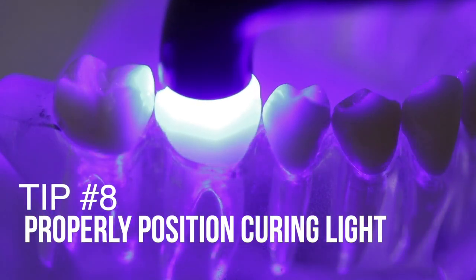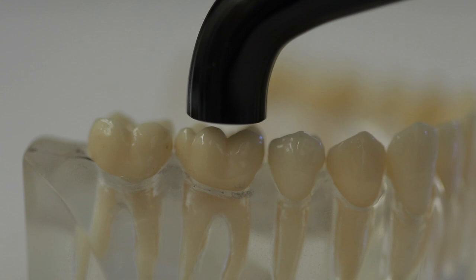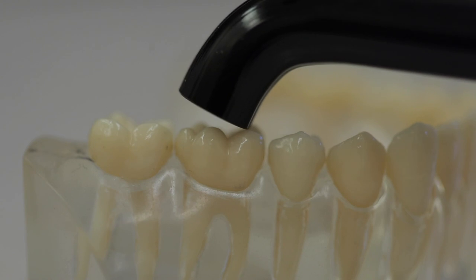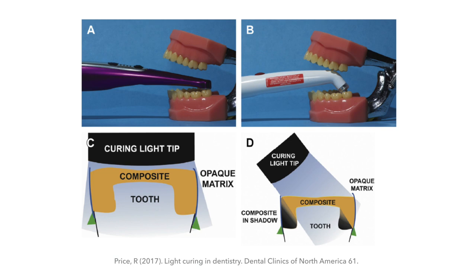Tip number eight: properly position your curing light. When you place the curing light over the tooth, you want it directly over the material, perpendicular to the surface, and as close to that material as possible. Perpendicular angulation is important because deviating from perpendicular reduces light intensity and depth of cure. This is also something to consider when shopping for a curing light — look at the tip angles and understand how easily you can access certain areas of the mouth.